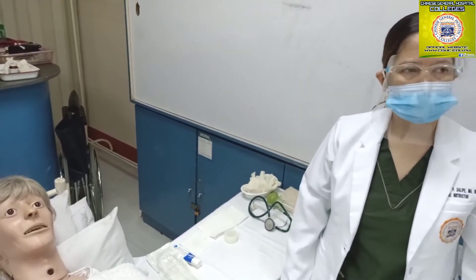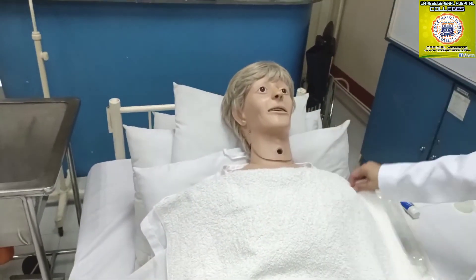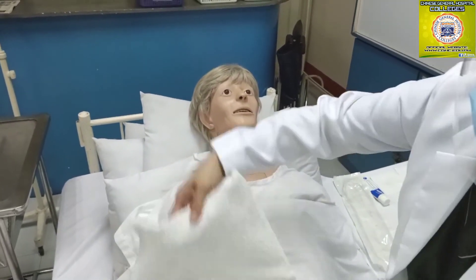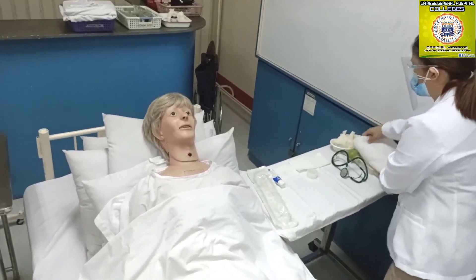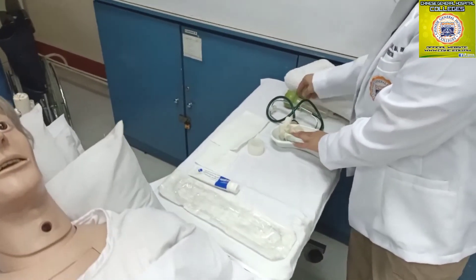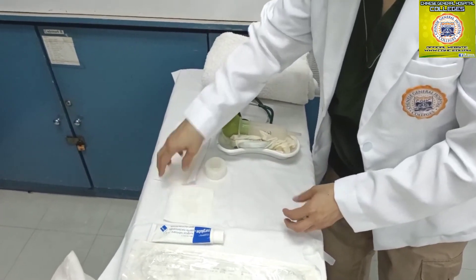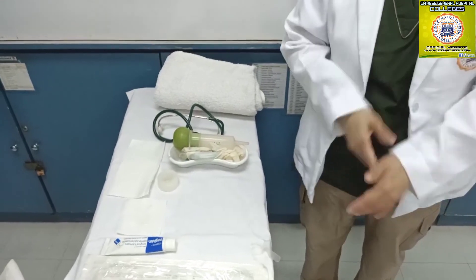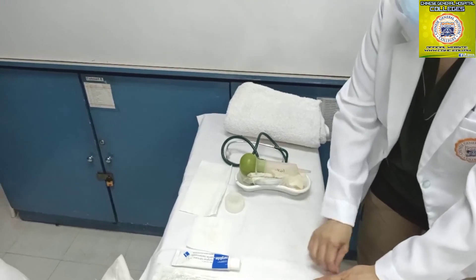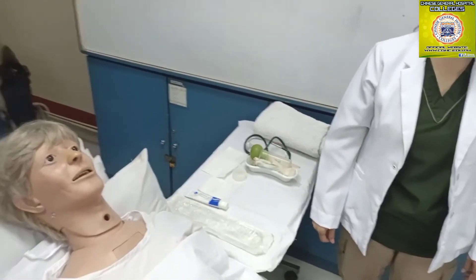Assist with mouth care and make the client comfortable. For the post-procedure steps: clean the equipment, dispose of used supplies, wash your hands, and document the time and date of insertion or removal, the type and size of tube, the client's response, the characteristics and amount of aspirate.